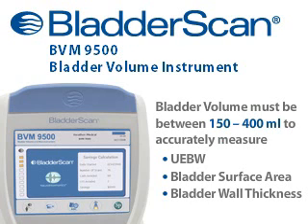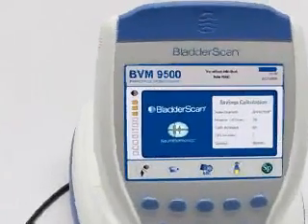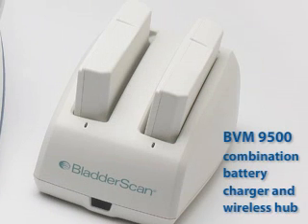The BVM9500 also provides the option to manually measure bladder wall thickness when bladder volume is between 150 and 400 mL. The BVM9500 consists of a battery-operated color display console, a handheld ultrasound probe that scans the patient's bladder, and a combination battery charger and wireless hub.